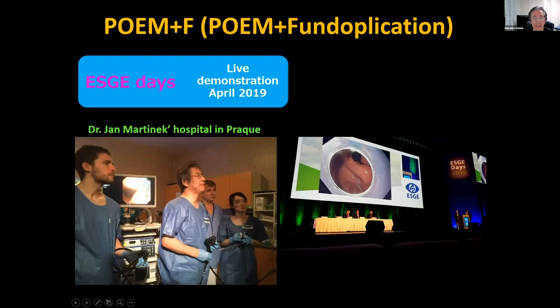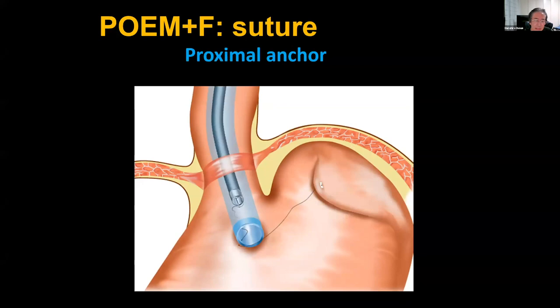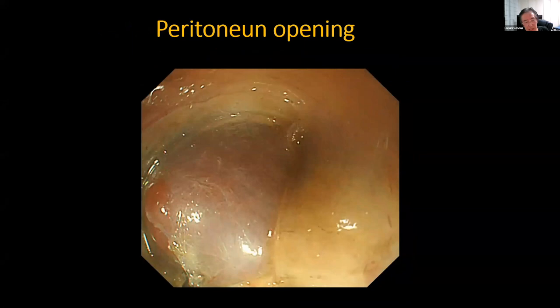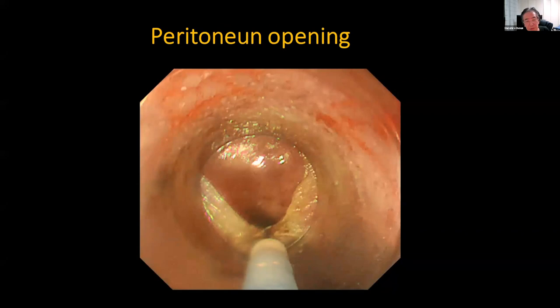To complete this procedure, we use an endoscopic hand suturing device and V-Loc suture. First, we place a distal anchor onto the anterior wall of the gastric fundus, then place the proximal anchor close to the junction — we put two stitches. In this video clip, we place the anterior myotomy first, then enter the abdominal cavity at the end of the submucosal tunnel, dissecting the peritoneum. Behind you can see the back side of the left liver lobe.